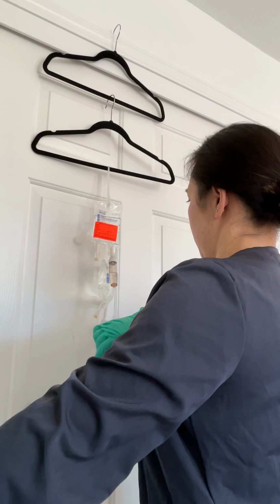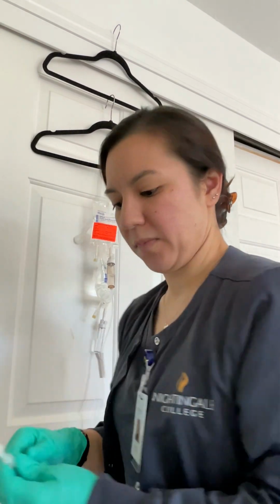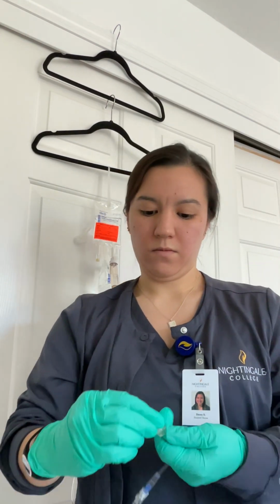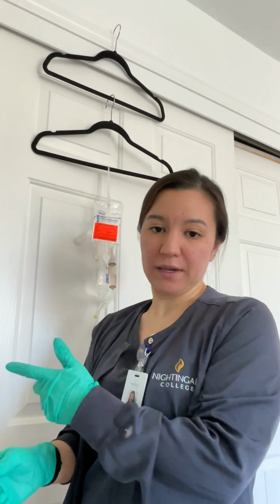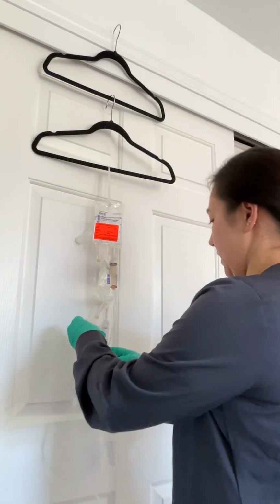All right. So 100 drops per minute. And now this can be attached to our patient and we can regulate the drops. All right.